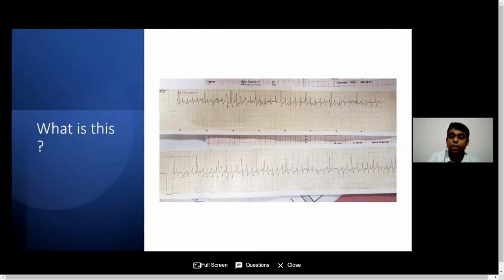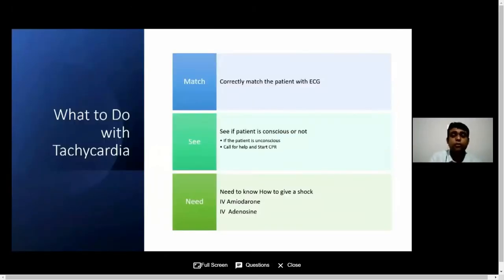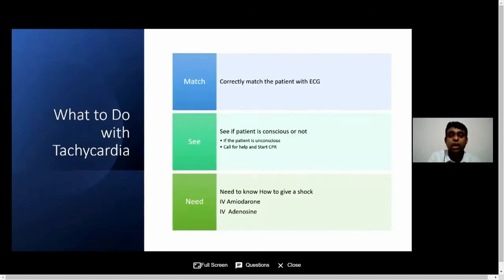Do you remember I was mentioning artifacts? You can see this is an artifact. So before jumping to the patient, you need to make sure that the patient's ECG and symptoms correlate. If you come across a patient with an abnormal rhythm, make sure you confirm it is the right ECG for the right patient. If the patient is not conscious, call for help and start CPR. You need to make sure to get your defibrillator ready, and medications like amiodarone or IV adenosine ready.